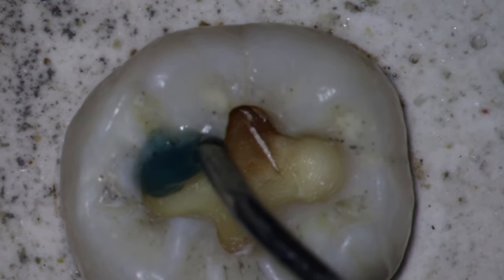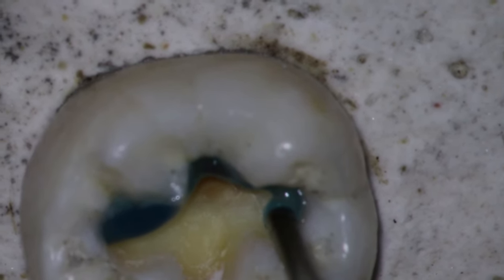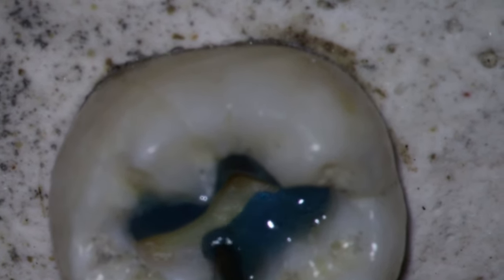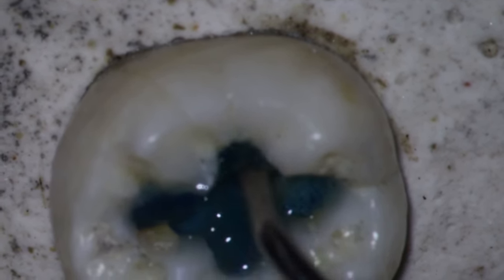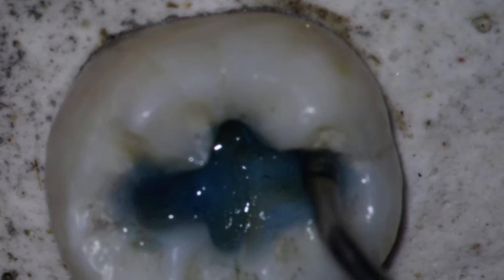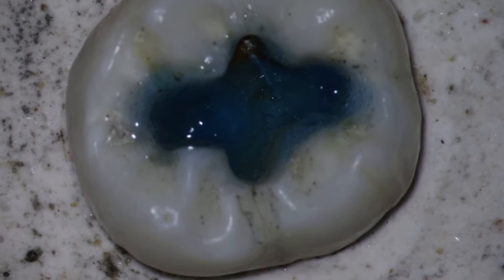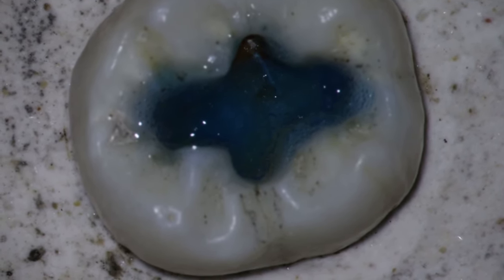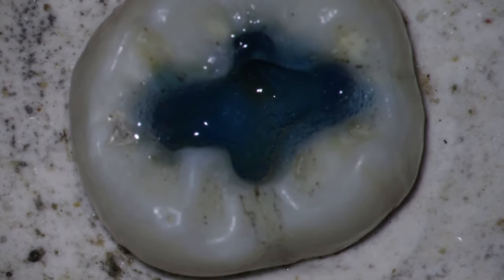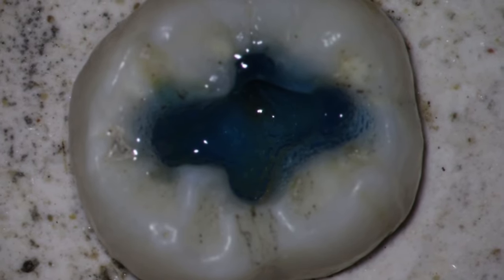So the gel basically helps you to restrict your etchant application, but since we are doing a total etch technique, we want to apply it both to the enamel and the dentine. So that is when it is called as the total etch technique. If you only apply it to the enamel, then it is called as the selective etch technique. So once you apply this, you have to wait for 15 seconds and then you have to wash.